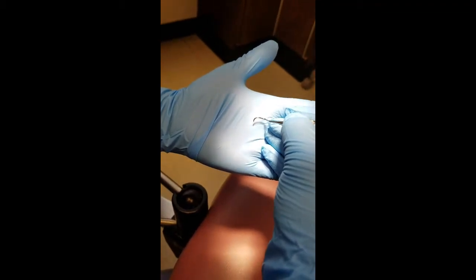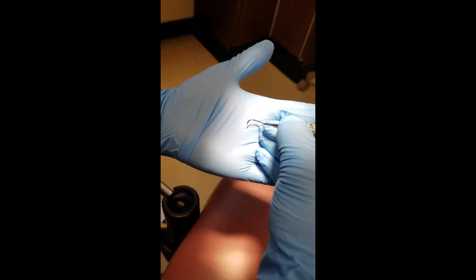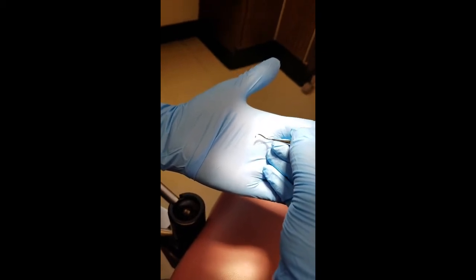The 204S is a sickle scaler used in the posterior sextants of the mouth only. This periodontal instrument is used to remove medium to large size calculus from the crowns of teeth. This should never be used on the roots or subgingivally.